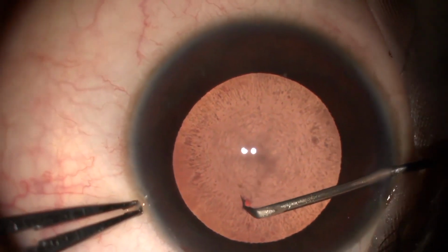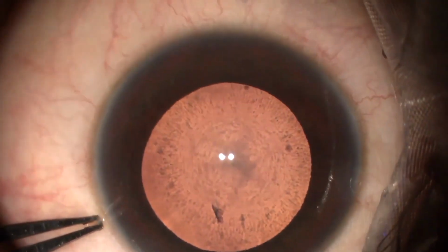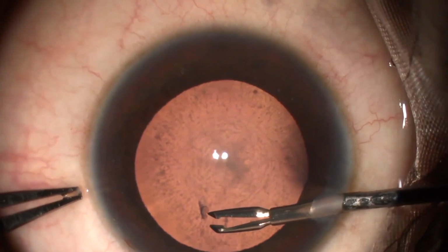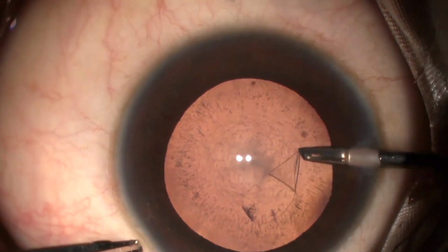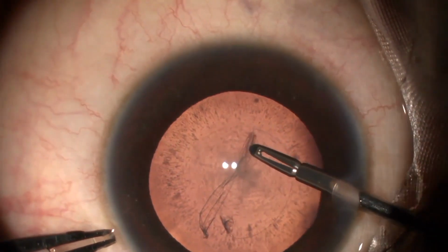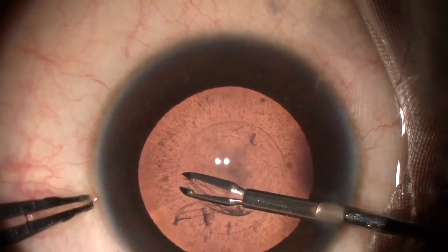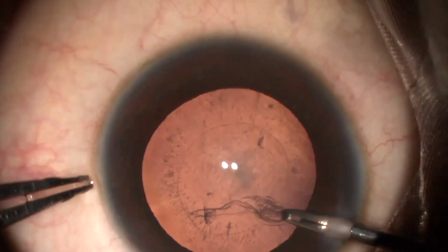Coaxial illumination provides a sustained red reflex throughout the surgery, enhancing the contrast for edge, size, and the course of capsulotomy, and can be used for better visualization of the capsulorhexis in cases of partial cataract when there is a good red reflex on coaxial illumination. The utility of this feature during a capsulorhexis is called coaxial rhexis.